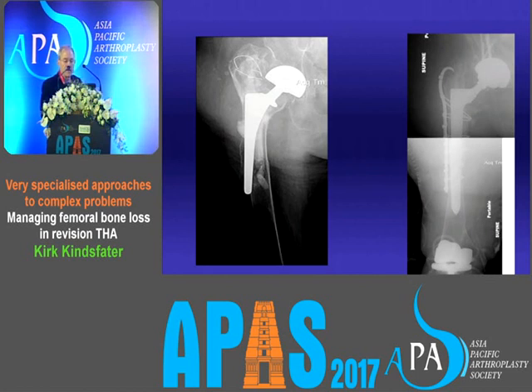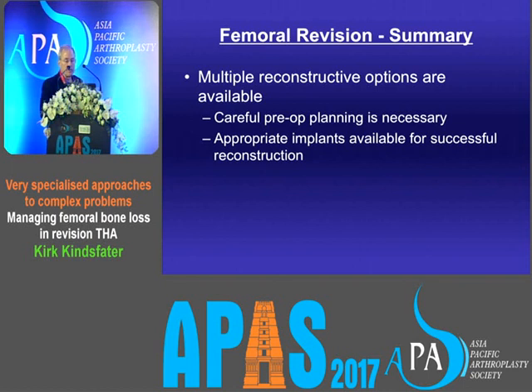Actually, able to fix the trochanter with this long trochanteric plate. The Wagner stem is placed, and the bone is almost soft enough that those cerclage wires almost act like a reduction osteotomy. Even though we haven't made any osteotomy, it can somewhat collapse the bone around the implant and give you stability. So in summary, we have multiple reconstruction options available.